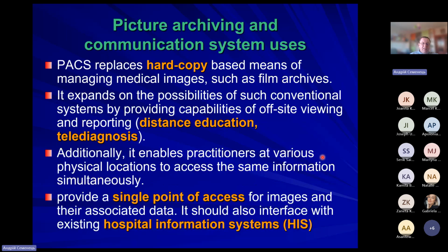In fact, PACS has to replace hard copy images, like those printed on films, and it offers many capabilities for physicians, like remote access of images, automated processing, and even delivery of images for telemedical consultation, and usage in distance education and so on.